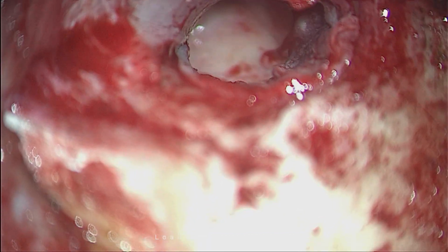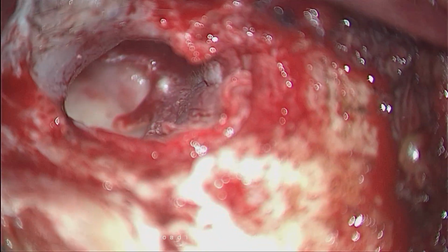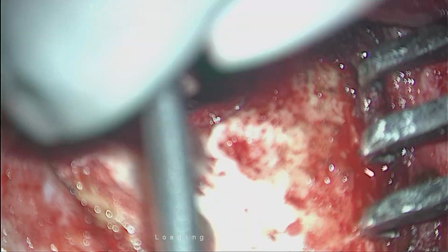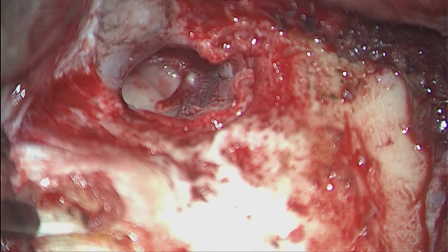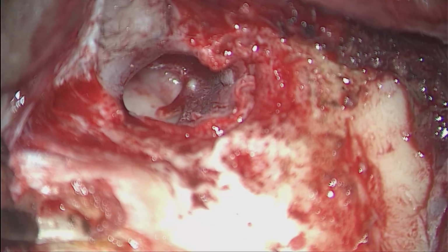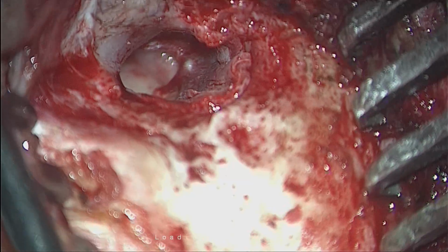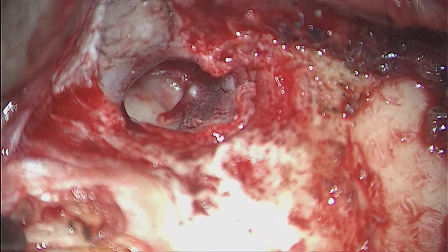Before grafting, what is left is assessing the mastoid air cell ventilation down the eustachian tube. We can assume in a dry ear that the aditus must be open to ventilate the air cells, but not always. We have seen aditus blockage even in long-standing dry ears. And that is one thing which can have a negative impact on the outcome if it is left unaddressed.